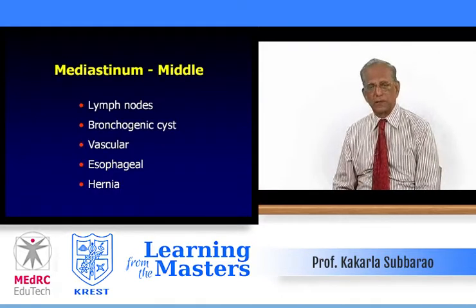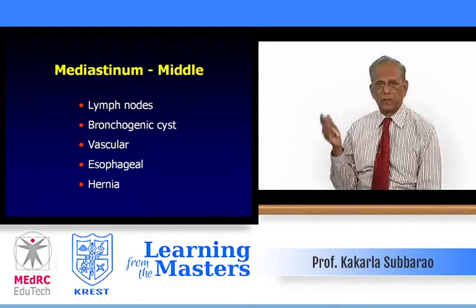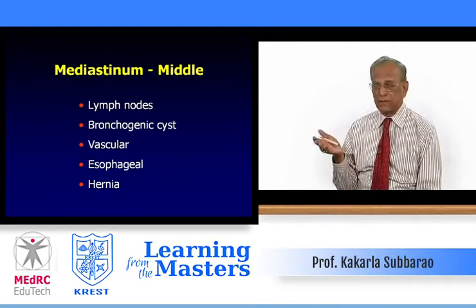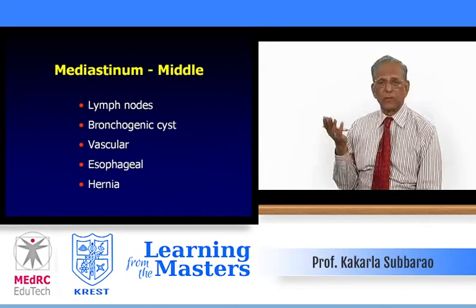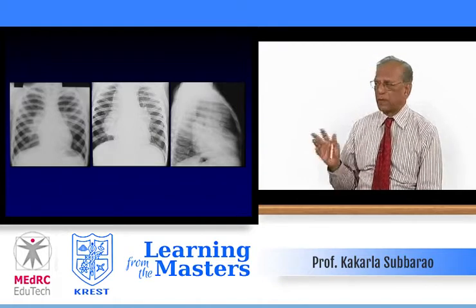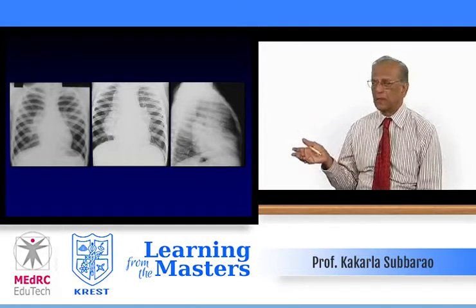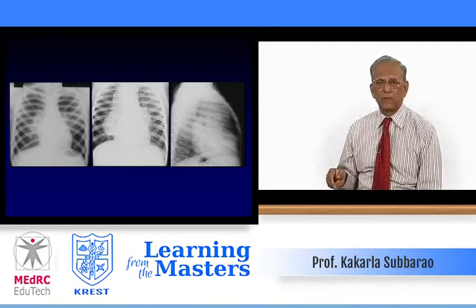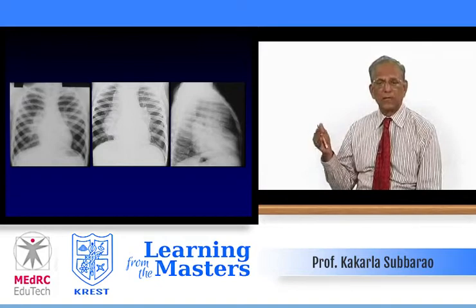Now we come to the middle mediastinum. Common structures here include lymph nodes, perihilar nodes, bronchogenic cysts, vascular structures, the pulmonary artery, part of the aorta, the esophagus, and hiatal herniations through the esophageal hiatus. Right paratracheal nodes on the left film, and then right paratracheal and both hilar nodes — this proved to be tuberculosis. In our country in childhood, we think of tuberculosis first, and then only lymphoma and other conditions.